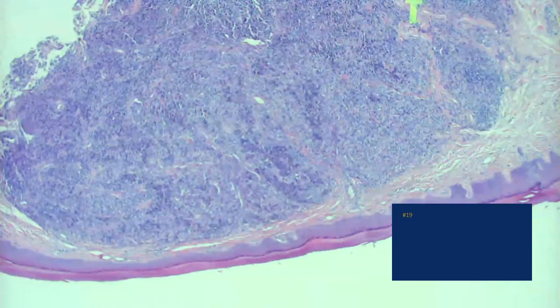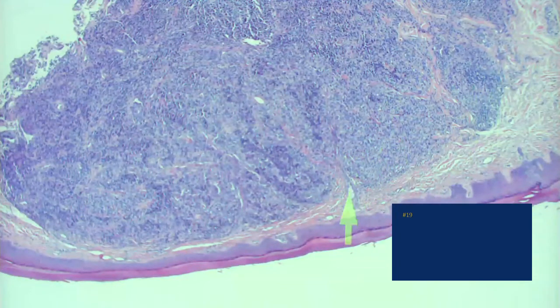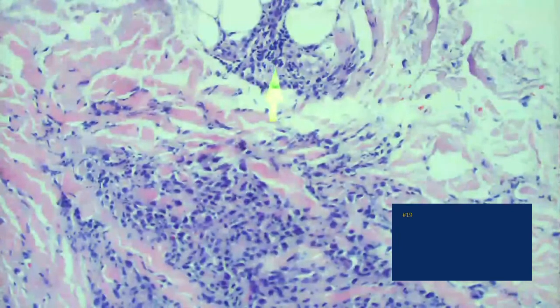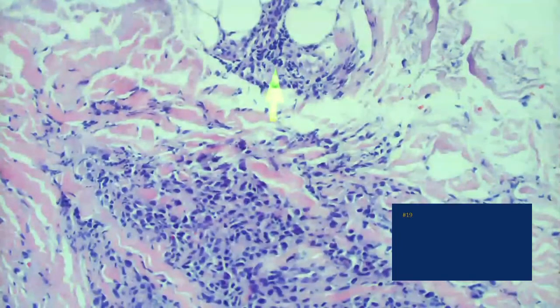Lymphocytes. Yeah, some of them might be, but some of them have a relatively abundant cytoplasm, don't they? They're much larger. So a lymphocyte is probably going to be maybe this size, that little teensy tiny cell there or there. These are way larger than that. They have abundant cytoplasm that's kind of pale. So let's say these are lymphocytes here. They look like little tiny jet black dots at low power. But these cells up here, obviously not lymphocytes, are they? No, they're not.